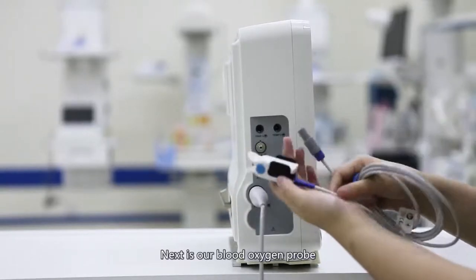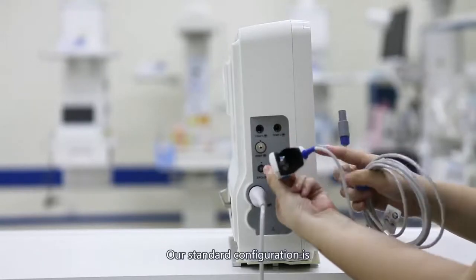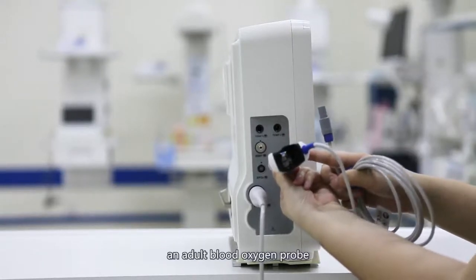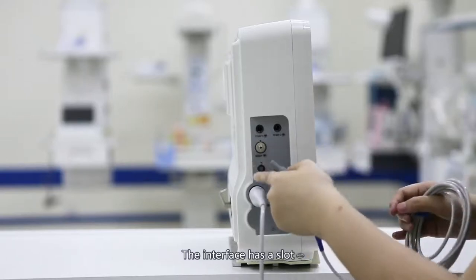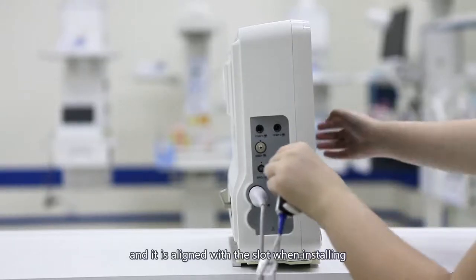Next is our blood oxygen probe. Our standard configuration is the clip-type blood oxygen probe. The interface has a slot, and it is aligned with the slot when installing.